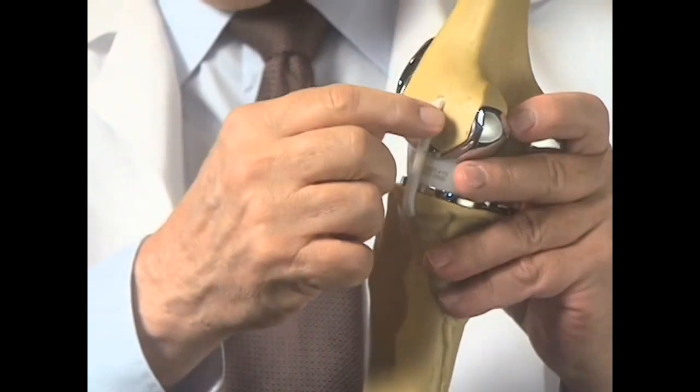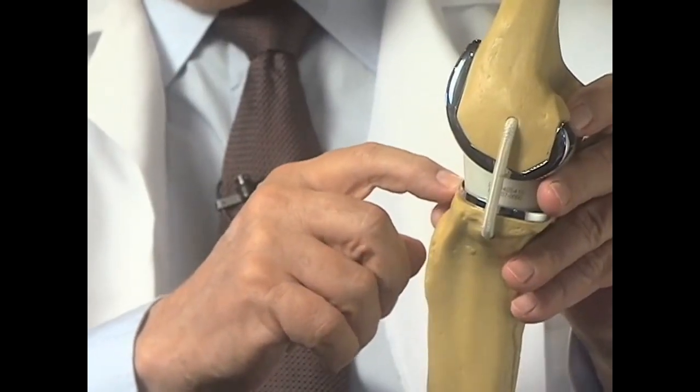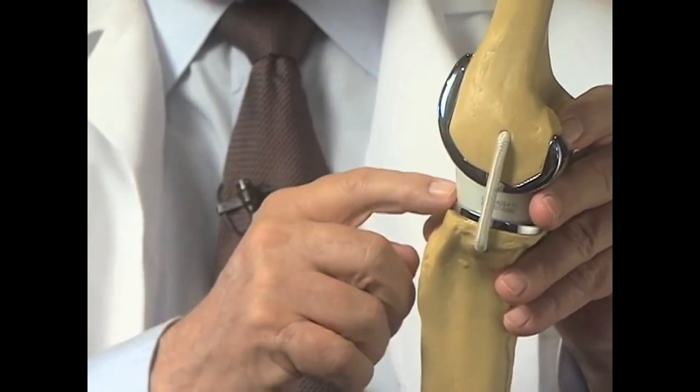We remove a very thin layer of bone from the lower end of the thigh bone, and then we replace it with a metal cap. Look at the thickness of that metal cap — it's less than a third of an inch, and that's about the amount of bone that's removed. On the shin bone side, the amount of bone removed is as thick as this metal cap, and that's replaced with a metal cap as well. Sandwiched between the two is this plastic piece, which replaces all the moving parts in the knee, so there's no arthritis left inside the knee.